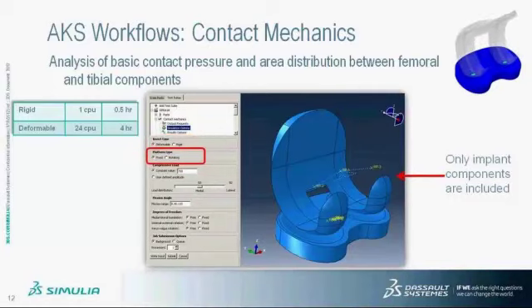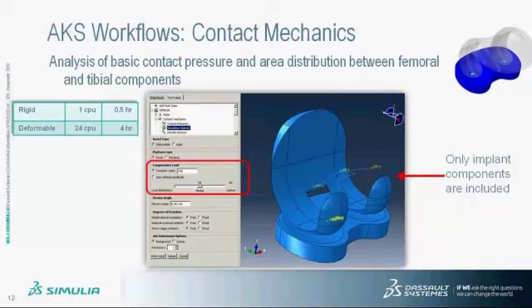Another common option is the platform type. This refers to the insert on the tibial components. So the platform can be either fixed or rotating, depending on the design you are trying to evaluate. During the analysis, a compressive load is applied on the femur component, and the value can be either a constant value throughout the analysis step, or it can be varied using an amplitude curve. The distribution of the load between the medial and lateral side can be specified by the user using the slider bar.